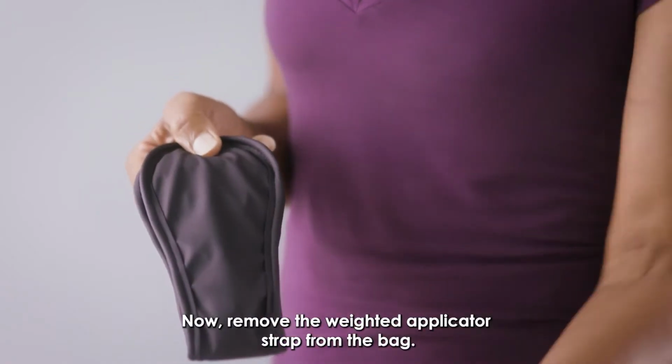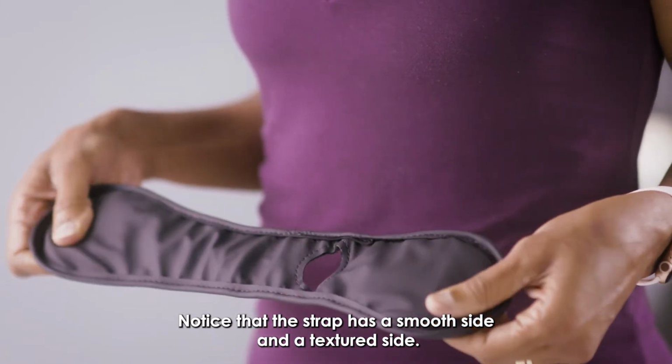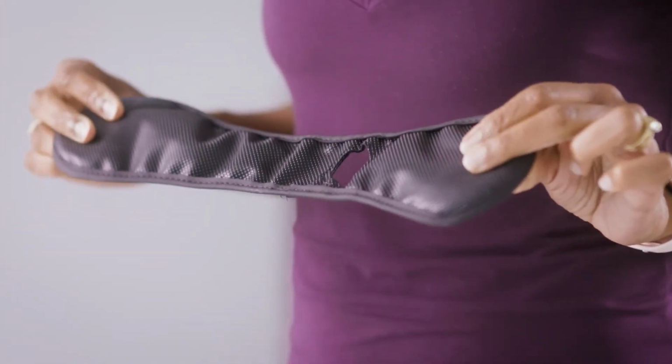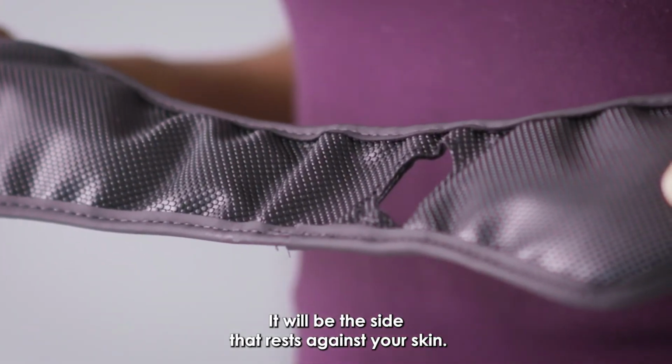Now, remove the weighted applicator strap from the bag. Notice that the strap has a smooth side and a textured side. The textured side is the back. It will be the side that rests against your skin.